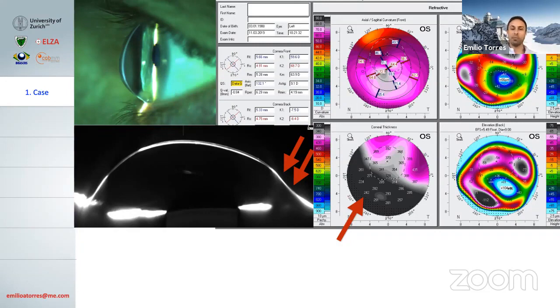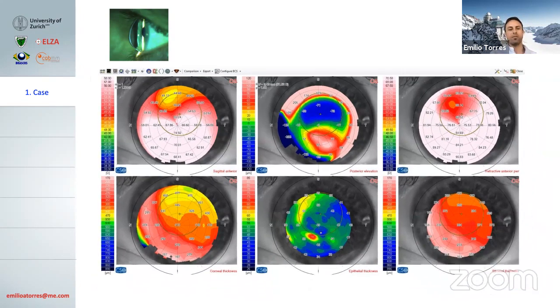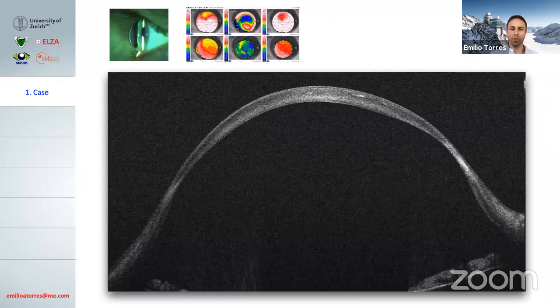Of course, this limitation of Scheimpflug also affects our ability to estimate pachymetry or the thickness of the cornea. You can see the corneal thickness profile here, quite homogeneous from the inferior half of the cornea, and we questioned if this was really the case of our patient. On the other hand, here we can see measurements with OCT and Placido technology, and that was much closer to what we found clinically. The left inferior image now shows the corneal thickness profile of this cornea. Basically, these better measurements are possible due to an acquisition of images that have less noise than Scheimpflug. And here you can see very well how we see the back surface very clearly.